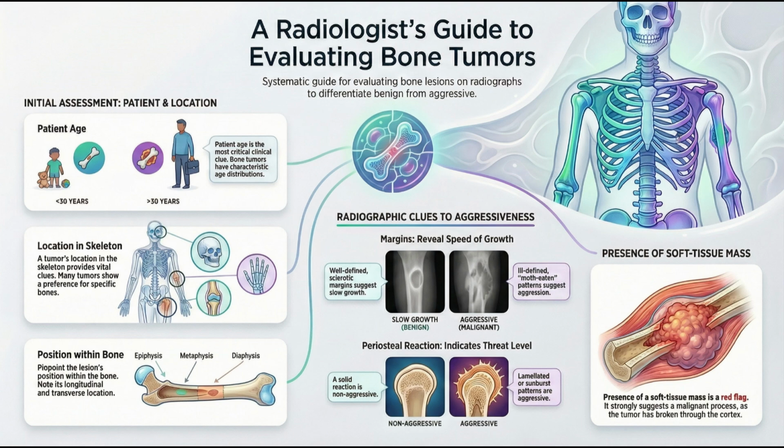You also have developmental mimics, like the cortical desmoid, a benign, self-limiting irregularity that can look like a suspicious tumor erosion. And infections often look like tumors. I'm thinking of the Brodie abscess. A Brodie abscess, yeah, a chronic form of osteomyelitis. It causes a lytic destruction and can mimic an aggressive osteosarcoma, especially because it generates its own unique periosteal reactions. And then you have metabolic mimics like chronic tophaceous gout, which causes erosions that look exactly like aggressive bone tumors.